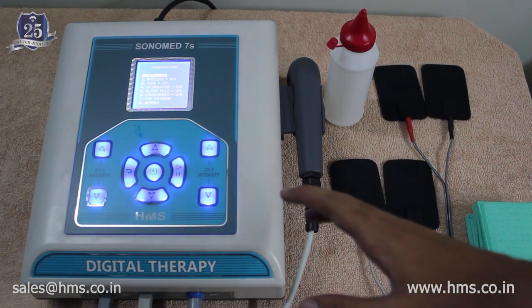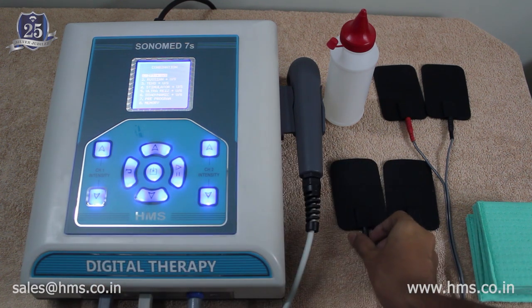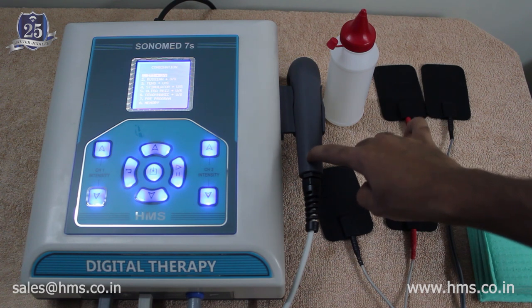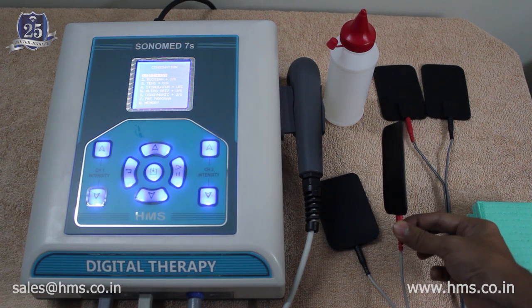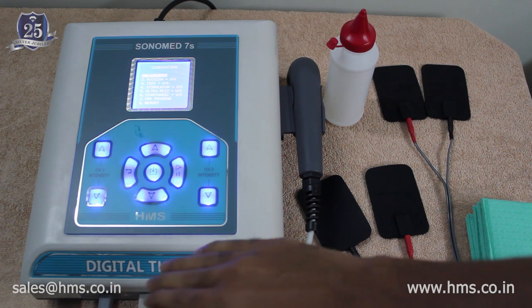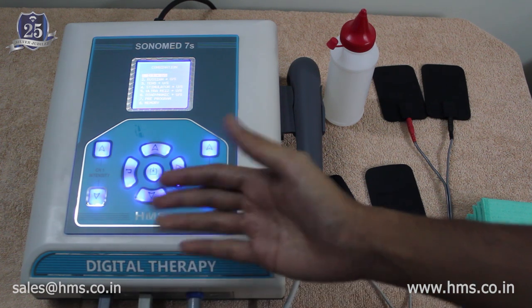In combination therapy mode, you should disconnect the channel 2 pin and use only channel 1. From the channel 1 cable, disconnect the negative (black) electrode, as its function is embedded directly into the transducer in combination therapy. Use only the positive electrode on the patient, while the transducer acts as the negative electrode. Channel 2 will have no output in combination therapy mode.